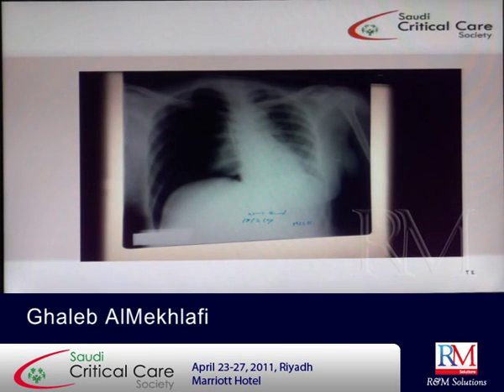This is pneumothorax. Okay, so be careful when you look at the X-ray. Look at it first before the doctor and see if there is pneumothorax or not.